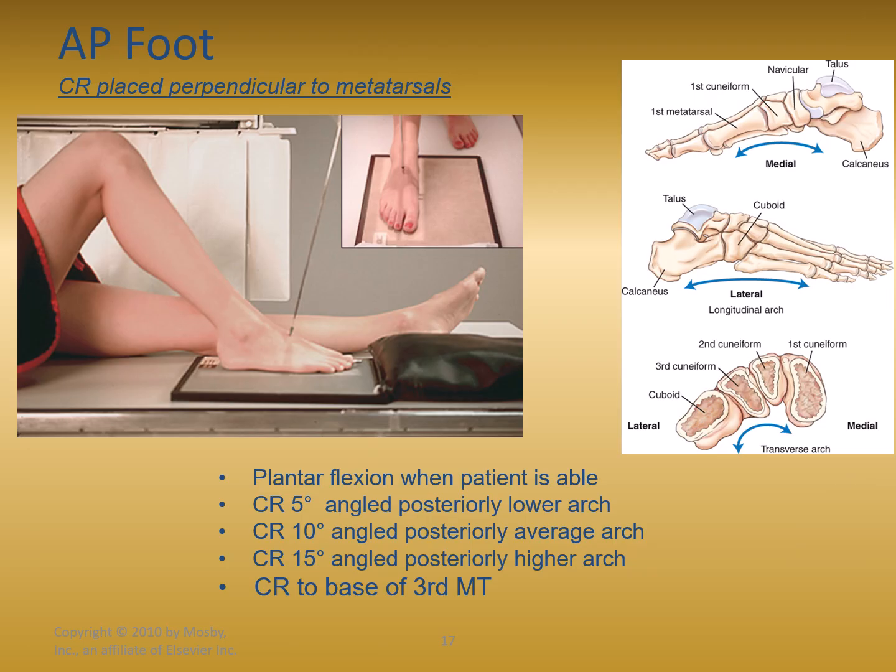So once again, we have to talk about that longitudinal arch and how it's shifting the metatarsals and the phalanges up away from the IR that we would be placing it on, right? So that arch brings part of the plantar surface away from the IR, putting those metatarsals and phalanges at an angle. That means the joints that we're trying to go through are also at an angle. So in order to go through those joint spaces, we have to angle the tube posteriorly. They call it posteriorly because we're angling towards the posterior of the foot.